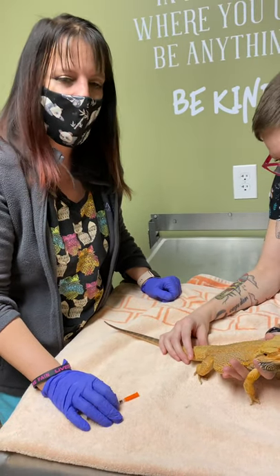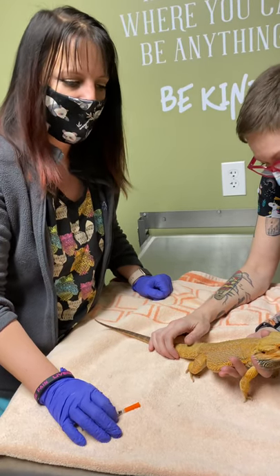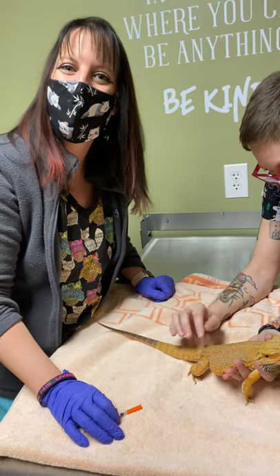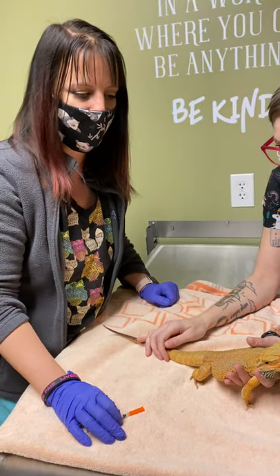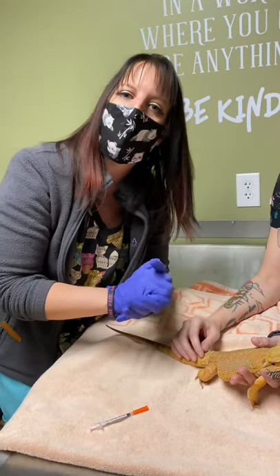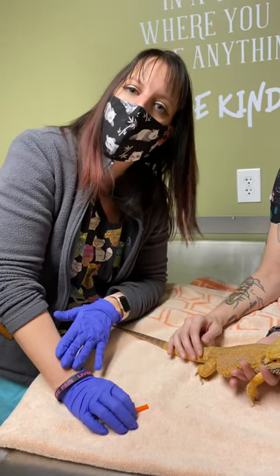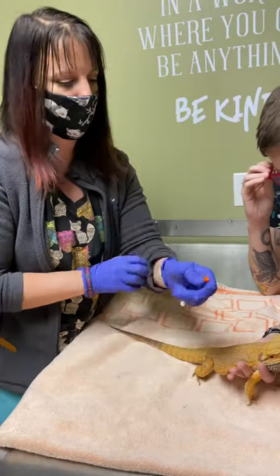Today we're going to show you how to give an IM or intramuscular injection in a bearded dragon. The doctor has sent you home with injections. Look at the label to see how often, and a lot of times they will actually have you freeze the injection until right before use.